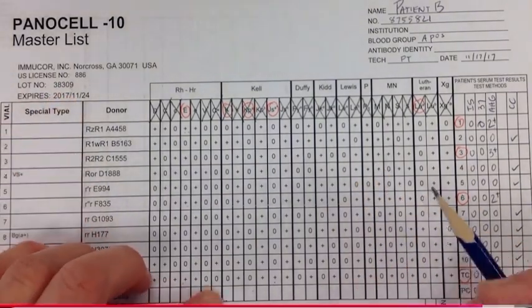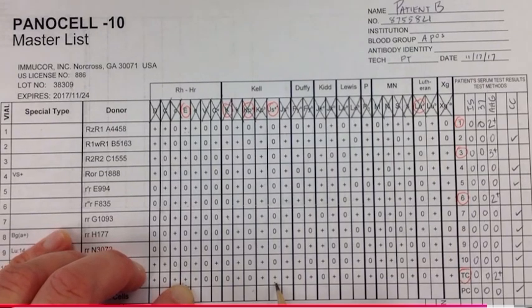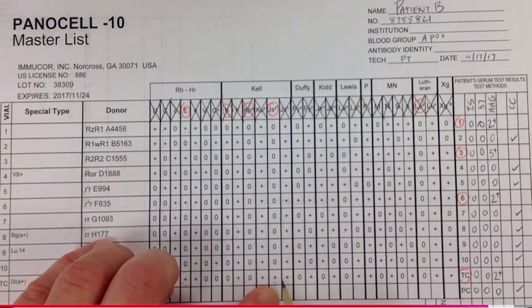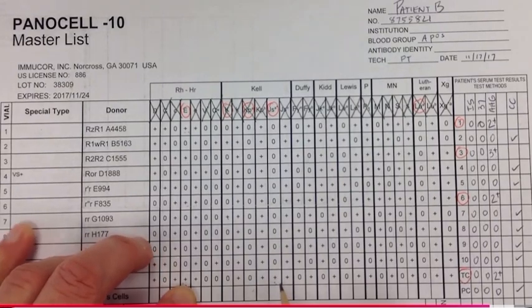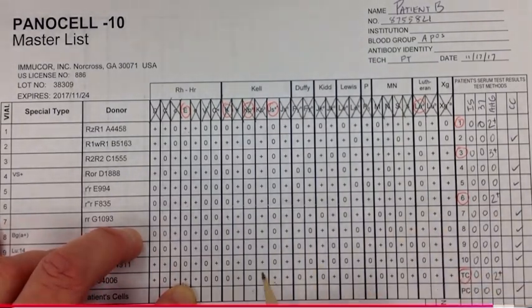So you have to go to a new lot number, and you're going to have to find a cell that is not, see, this one is positive for big E and positive for JSA. So you're going to have to find a cell that's negative for big E and positive for JSA. And then if you run that cell and it's negative, then that's going to tell you that it's probably not JSA.